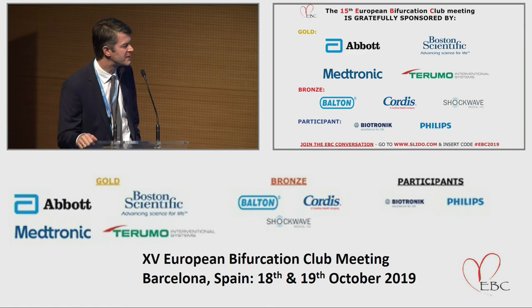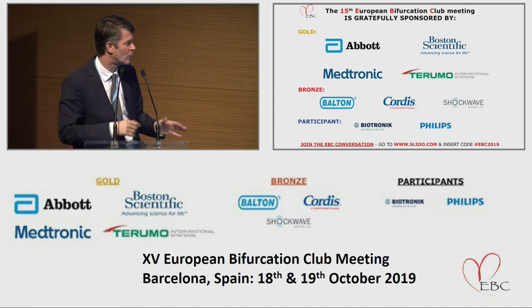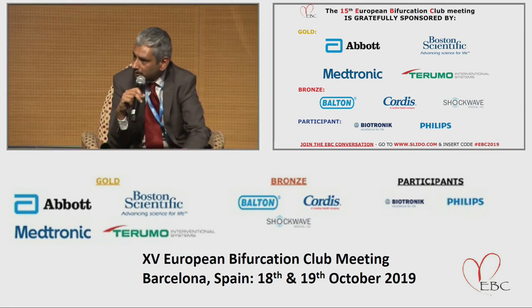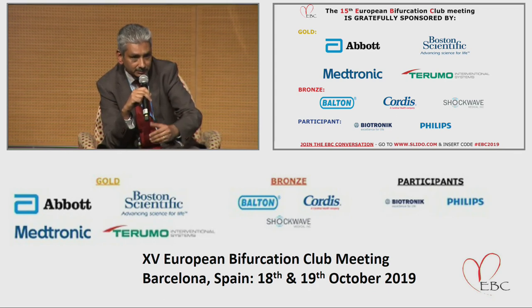What we have also seen is that we do not have this positive remodeling. We have quite the same late lumen loss, but we do not see the positive remodeling in the more calcified lesions, though we see comparably low rates of late lumen loss. That's good. I think the drug-coated balloon can be effective not just for the ostial side branch lesion, but also for a lesion extending a few millimeters into the side branch.